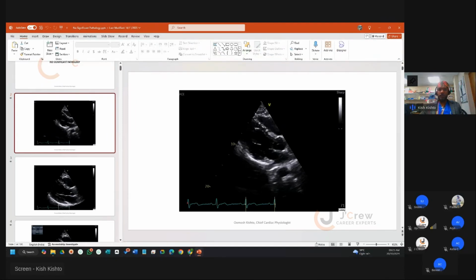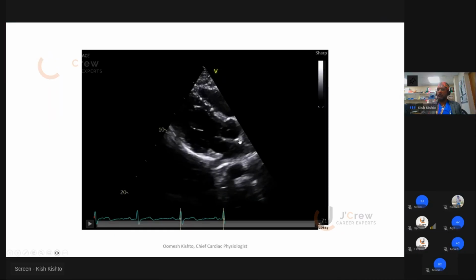The pathologies that we will be covering today would be AS, MR, regional wall motion abnormalities, and these kinds of things. If you have any question on these, we can talk about it. We will whiz through it, so not to worry.